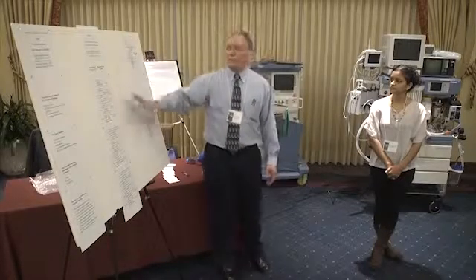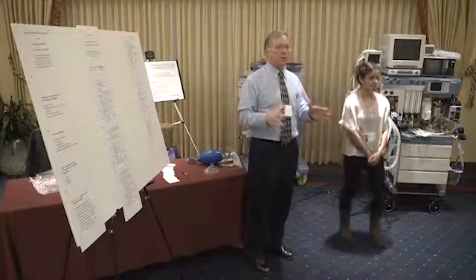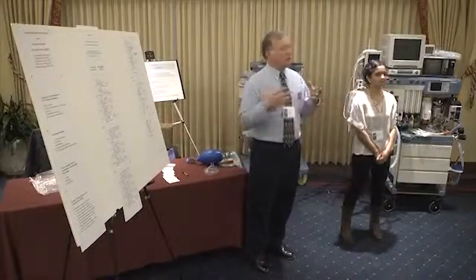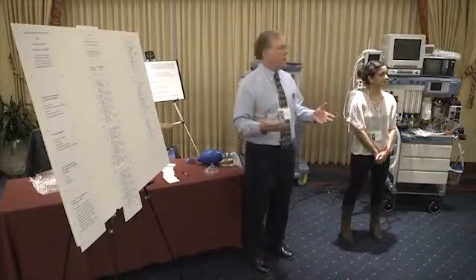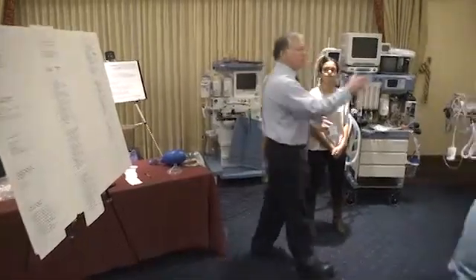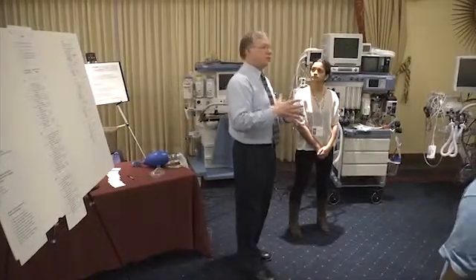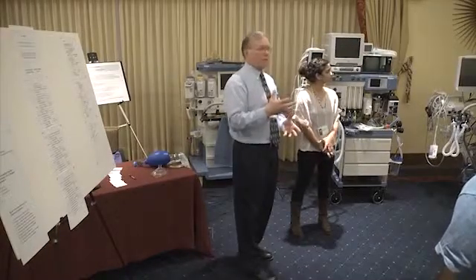From this set of guidelines, we want you to look at the machine that's in your facility and then develop your own anesthesia machine check. In other words, if you're checking the scavenging system, which will be one of your stations around here, it'll tell you to check your scavenging system, but you'll have to know how to check that specific scavenging system based on the type you have in your facility.